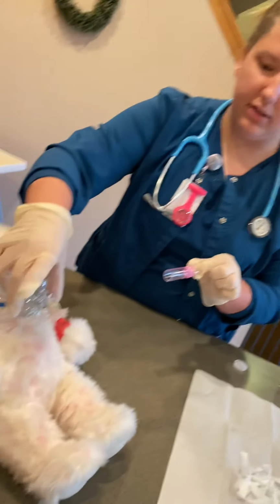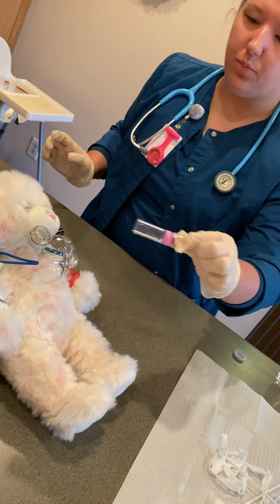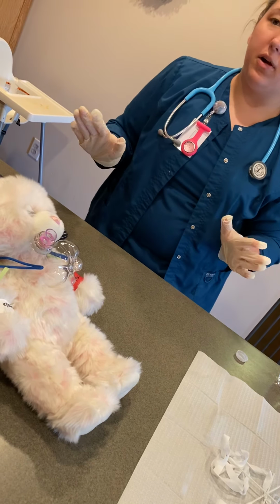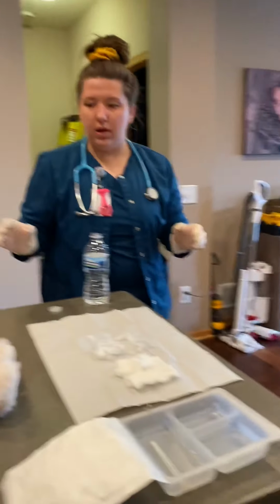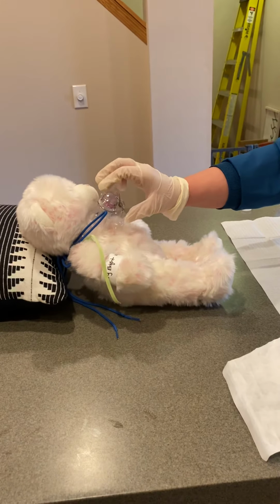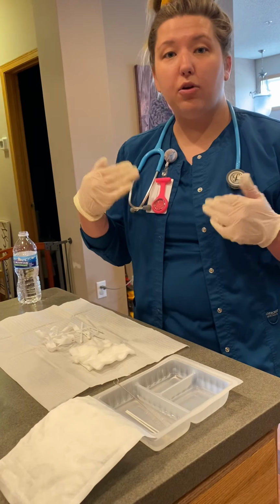So now that this part is done, I'm going to put this back in. And now the sterile part of this procedure is over, okay? So when I'm cleaning now, I'm going to make sure that the oxygen is back on. Okay, so now that that's good, I'm going to clean the outer parts of the trach.